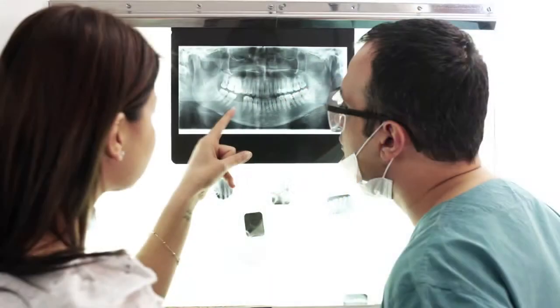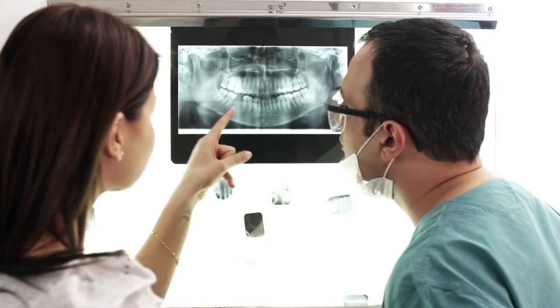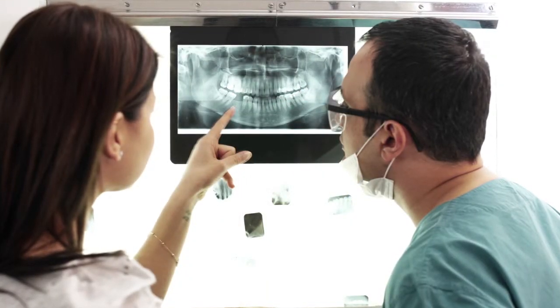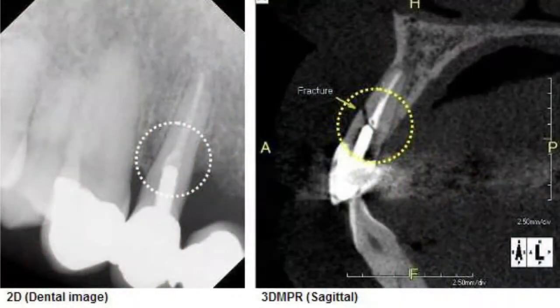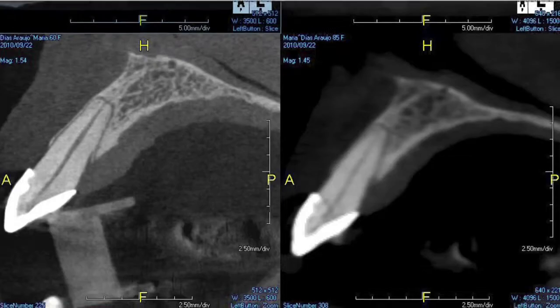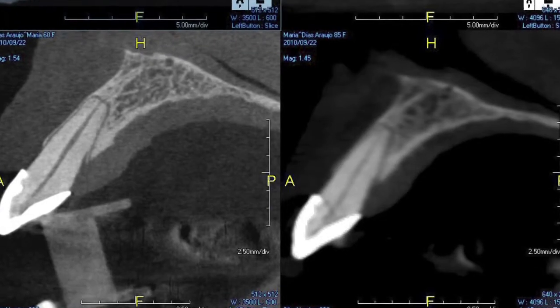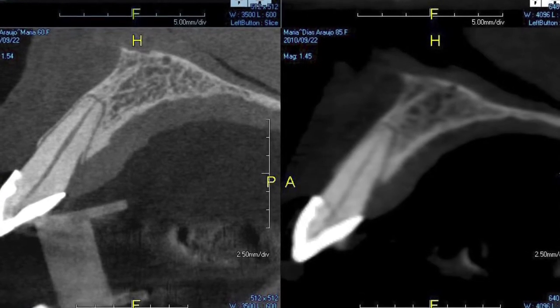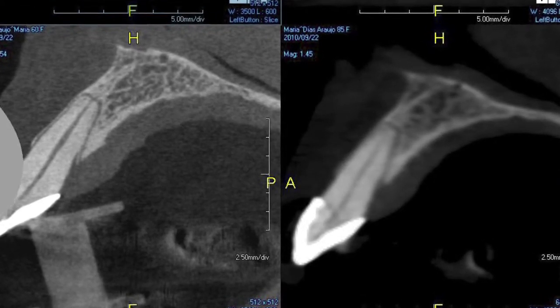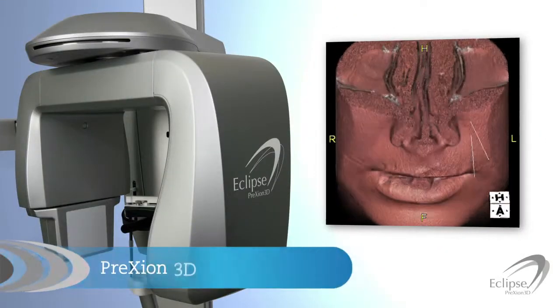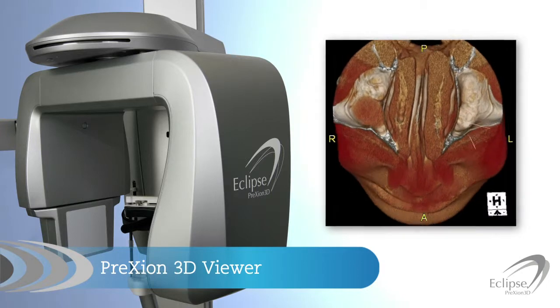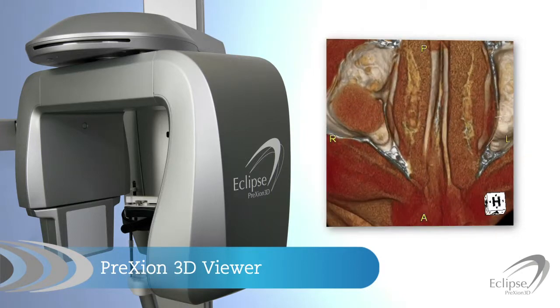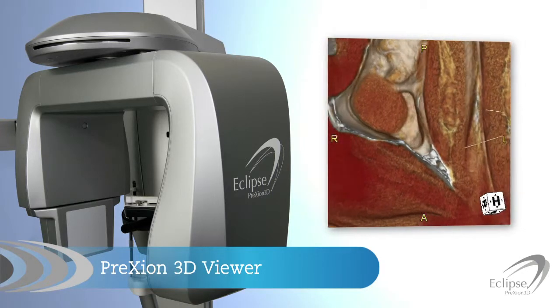As a dentist, you know that you cannot diagnose what you cannot see, and you cannot treat what you do not diagnose. A number of different 3D scanners promise clear images, yet only the Prexion 3D Viewer software provides you with unmatched diagnostic capabilities.